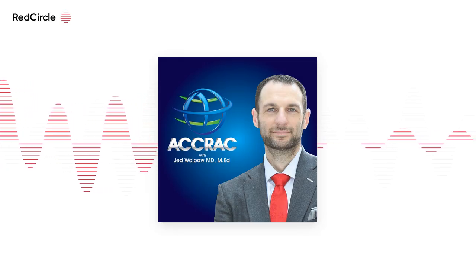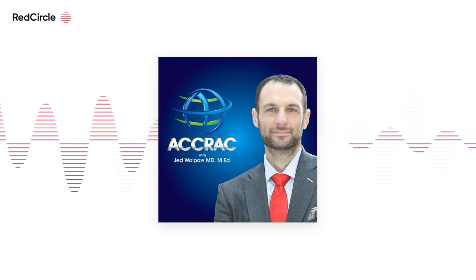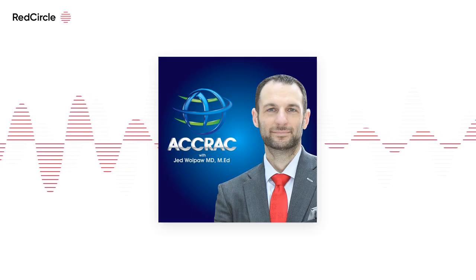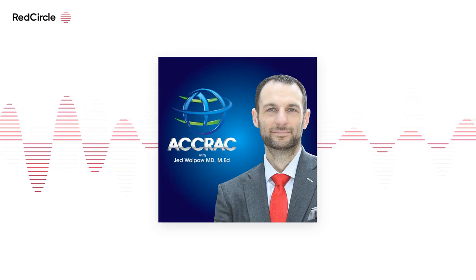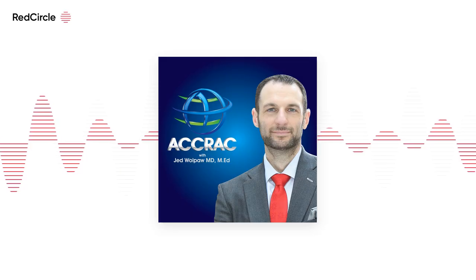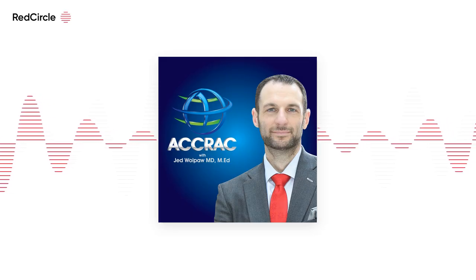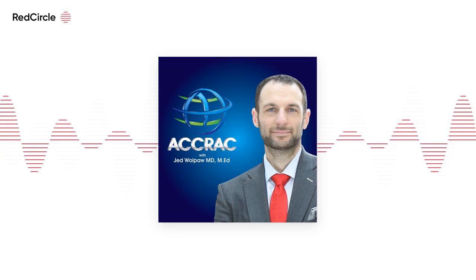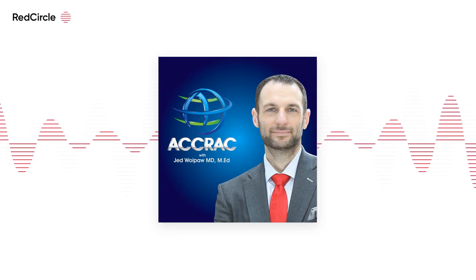And really, any tidal volume is going to be fine, because if you're below airway closure, you're not getting much volume in anyway. So typically I'll set a volume that I know is safe for the patient. In many patients, I would just set 300 or 350 mils for the maneuver, because if they're getting 300 mils in the lung, we're definitely past airway closure, because we're getting closer to physiological values.